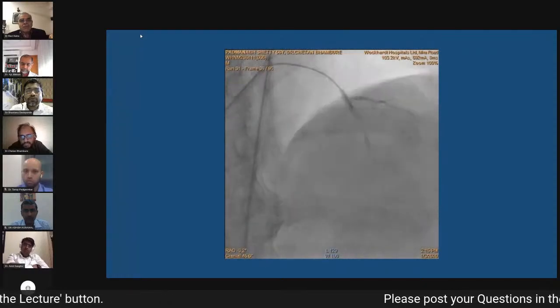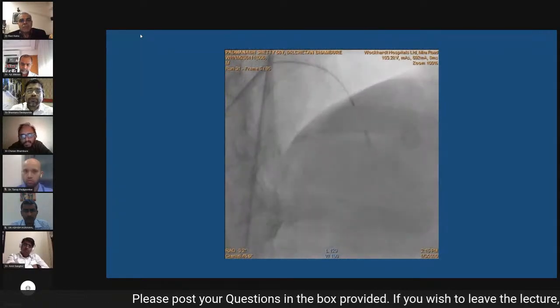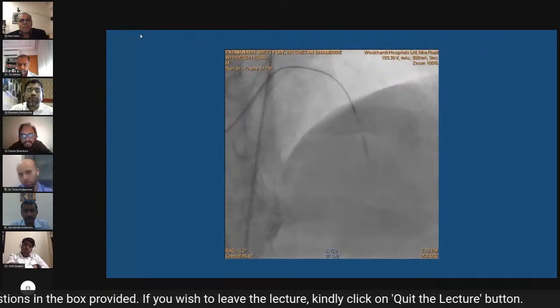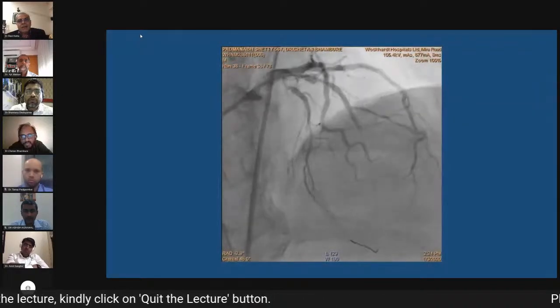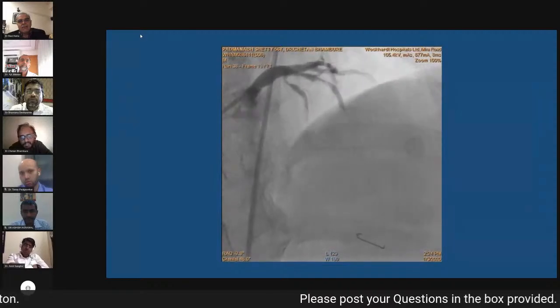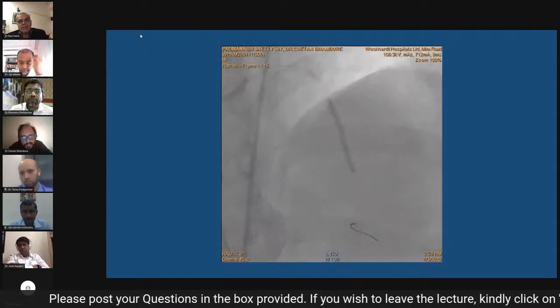So I found that I was in the LAD. I took the microcatheter a little back, again injected, and found out that there was a lesion again after that diagonal. After that, it became a little better. So things became a little clear. So I dilated it after the diagonals progressively till the proximal end. And then it was a little easier.